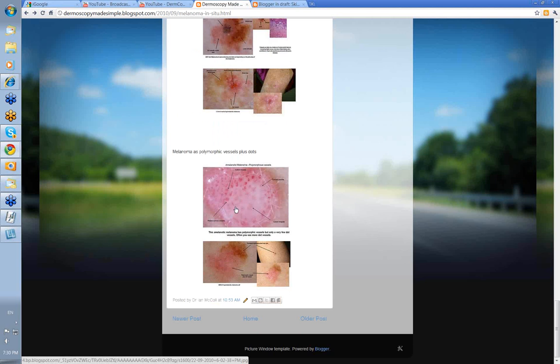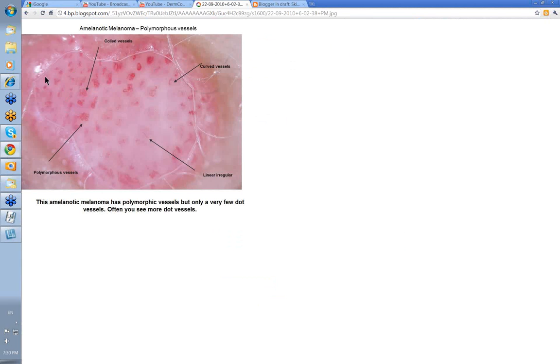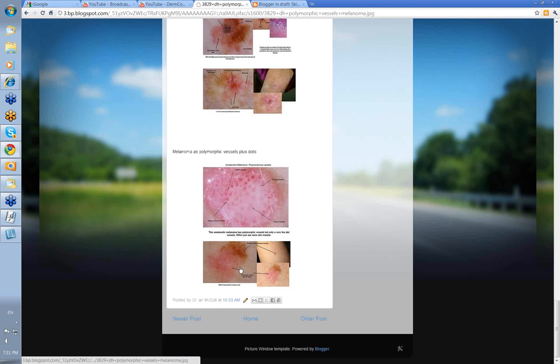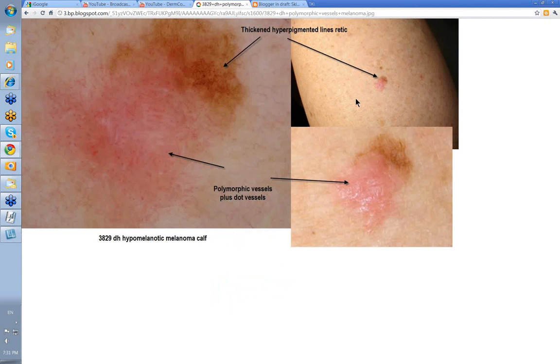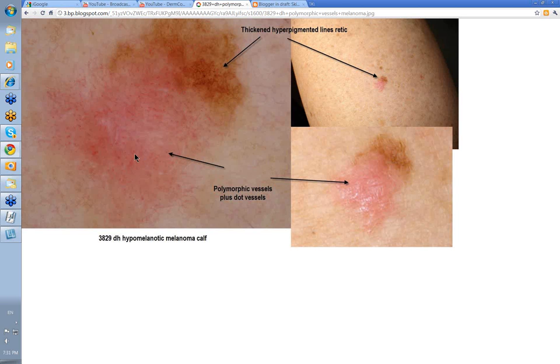And we'll end up with these two here — the amelanotic melanoma. Polymorphic vessels, there were a few dot vessels as well, not many in this. Usually we like polymorphic vessels plus dot vessels to allow us to make a definite diagnosis of amelanotic melanoma. And the last one — lesion on the calf. Thickened and hyperpigmented area here with the lines reticular. There were polymorphic vessels plus dot vessels in this amelanotic portion of this melanoma. So polymorphic vessels plus dot vessels are certainly highly suggestive of malignant melanoma of amelanotic type.